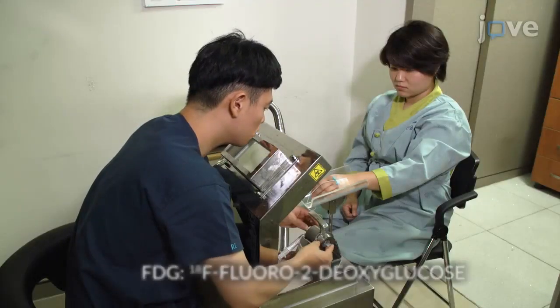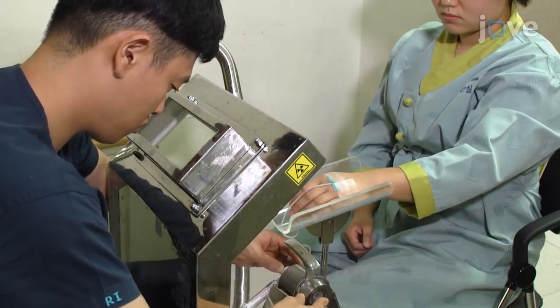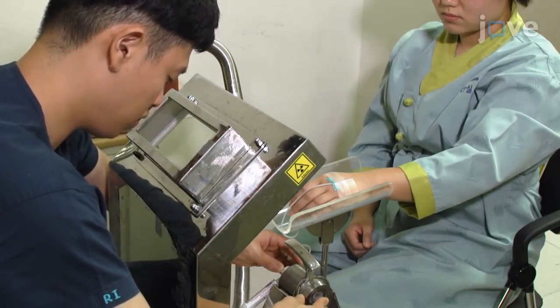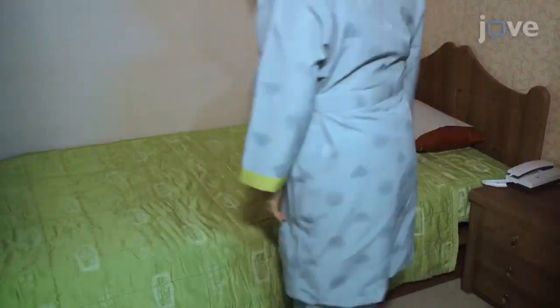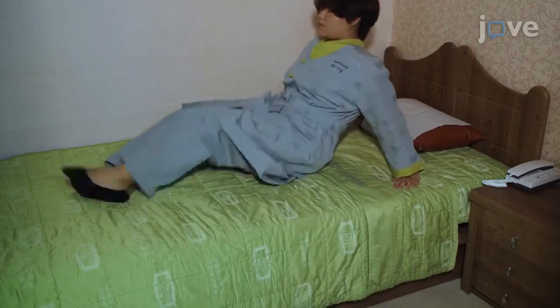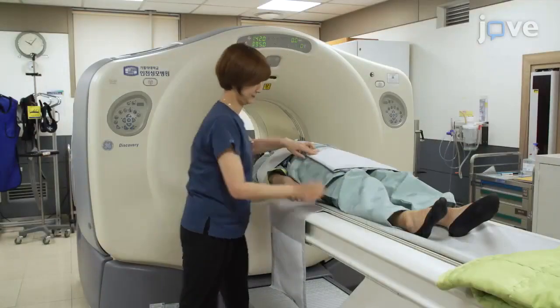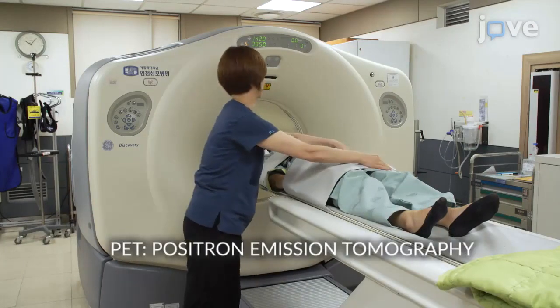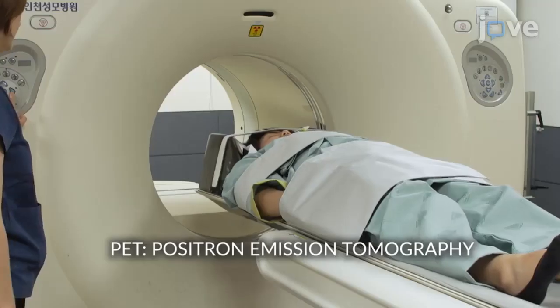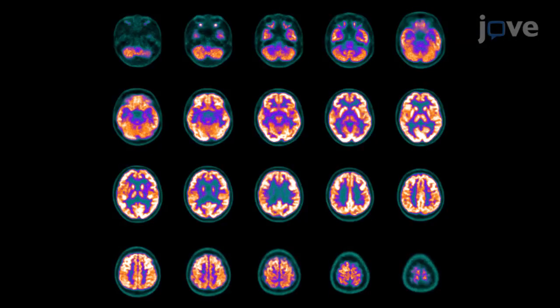To perform an FDG PET scan, inject each participant with 185 to 222 megabecquerels of FDG, and have the participants rest for 45 minutes in a supine position in a dark and quiet room with their eyes closed to allow FDG uptake. At the end of the uptake period, use a PET-CT scanner to acquire transaxial emission images and CT images in about 15 minutes, applying standard attenuation correction, filtering, and reconstruction techniques.